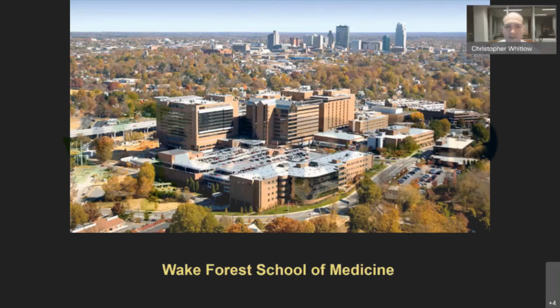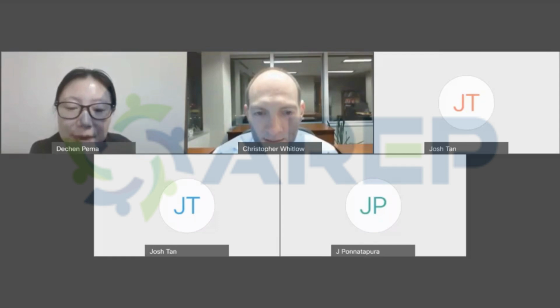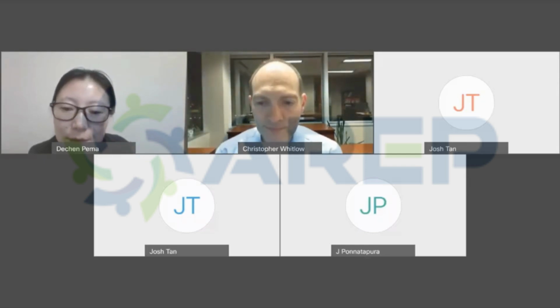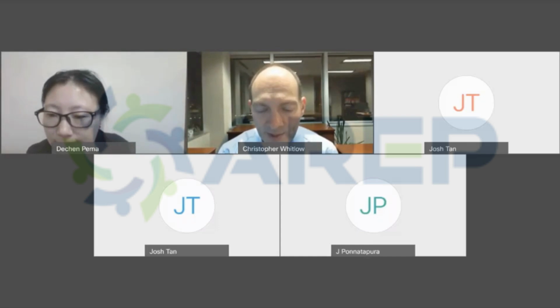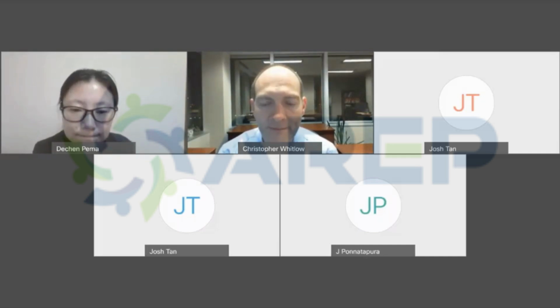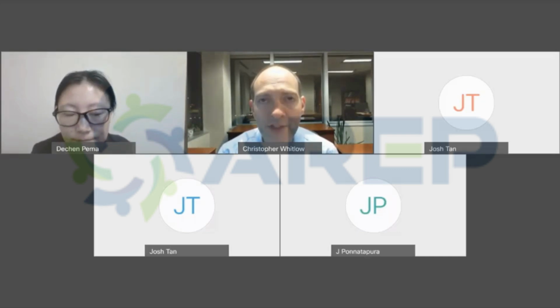For acute mild TBI, as you said, non-contrast CT is the first line. But for pediatric patients who are stable, can MRI be taken as maybe the first line? Potentially, I think so. One of the issues with MRI is accessibility. Often, at least in our healthcare system, we don't have MRI availability in the emergency department, and the other challenge with MRI is motion.